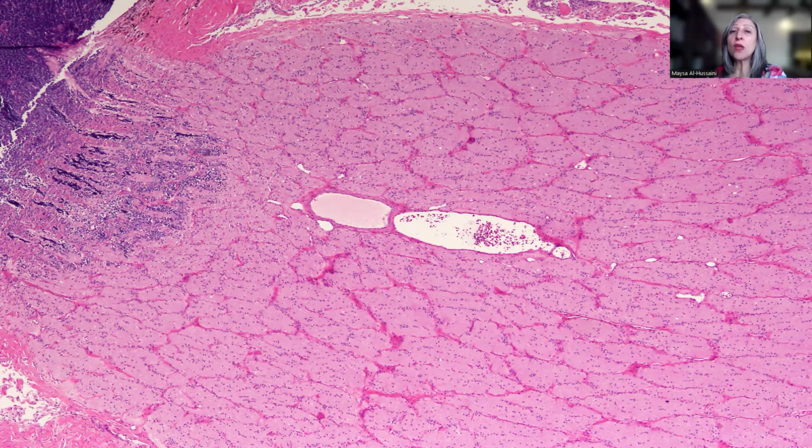This is why we have to keep on examining multiple deeper levels, sometimes 5, 10, 15, 20, whatever it takes, until we have a full face section of the tumor, as well as the optic nerve clearly dissecting or infiltrating or bypassing the sclera.